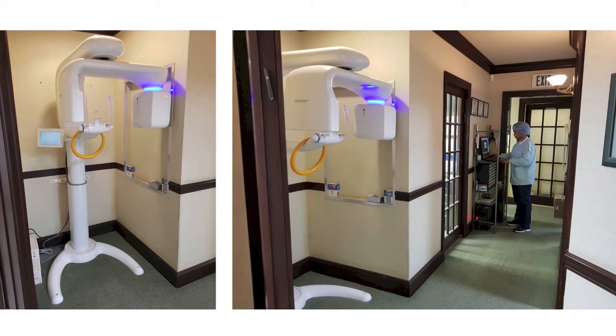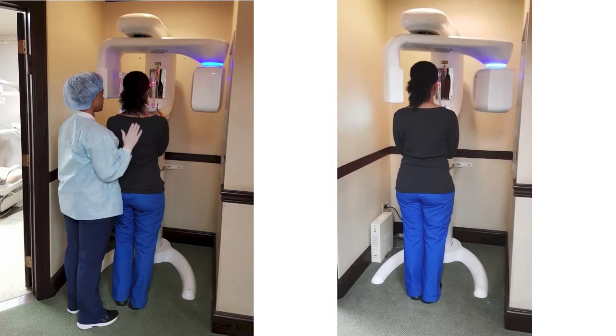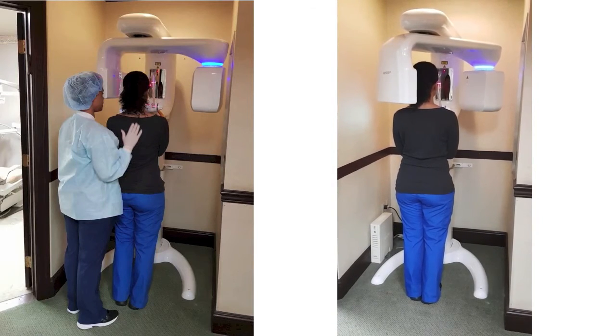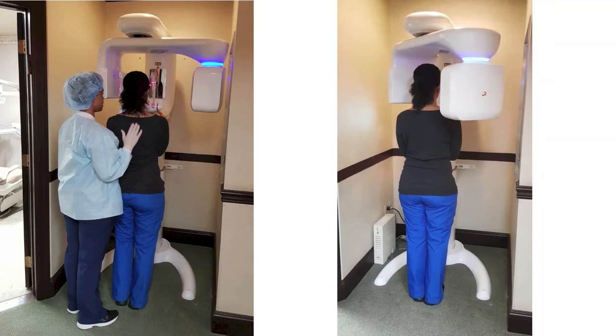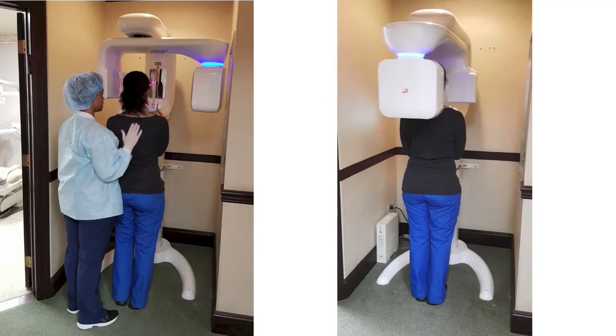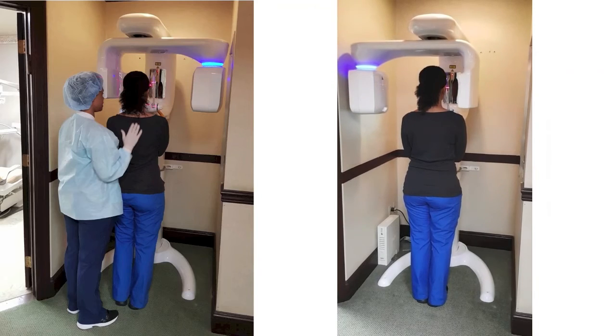And then you see Moya getting that set up, and there we have one of my other assistants. That's actually Tia, not Tidra, in there, just to show you how it operates. The patient's positioned in the machine, just like you're positioning the patient for a Panorex, with some slight modifications. There are positioning lights, and then the head of the machine rotates around the patient's head.